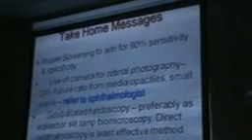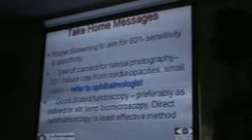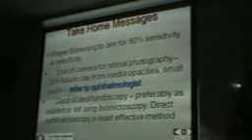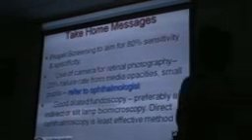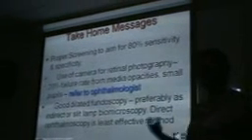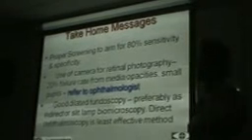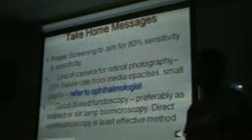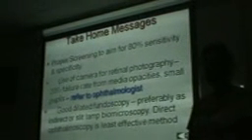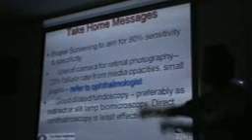Okay, proper screening for retinopathy. The WHO aim is to aim for 80% sensitivity and specificity. And of all the studies that have been done abroad and locally, they found that the retinal camera is the best way to get that 80% sensitivity and specificity. So if you're talking to your government, don't just say I'm wishing for high tech. It's actually documented in literature.